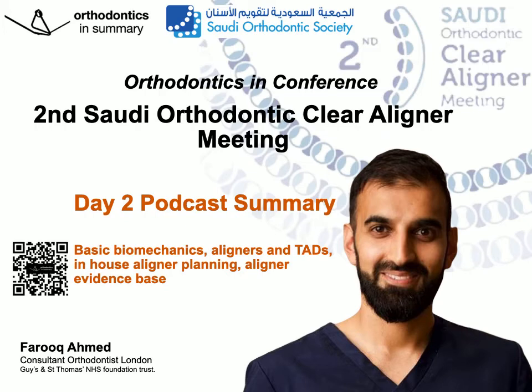He went on to describe his research looking at Invisalign First on 43 retrospective cases. The average treatment length was 9.7 months, and he described the amount of volume changes were significant, approximately 40% of expansion. He described other advancement options with Invisalign.